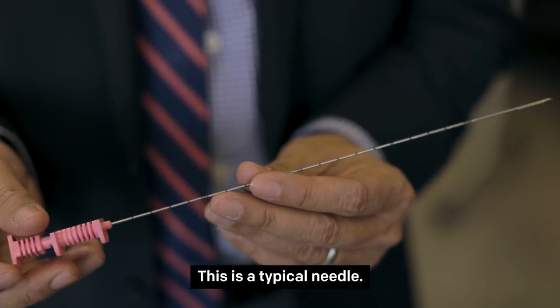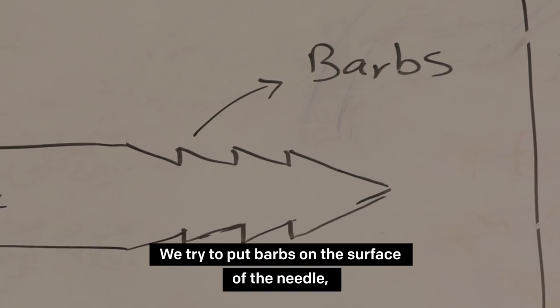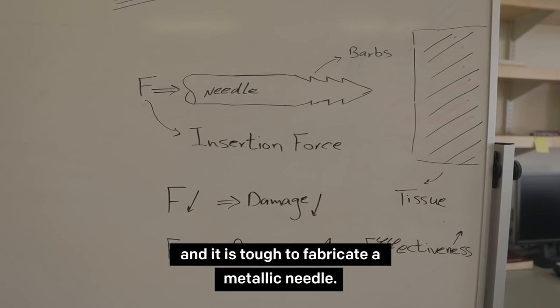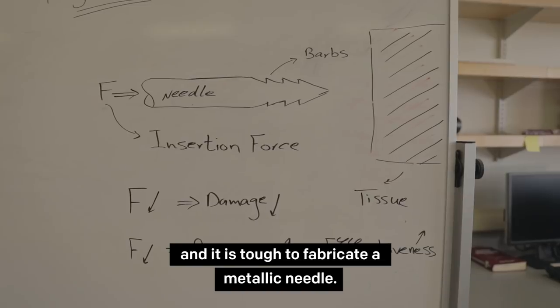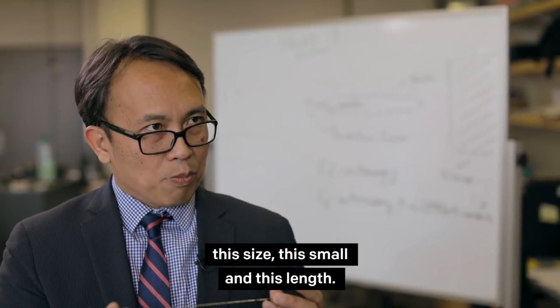This is a typical needle — this is metal. We tried to put barbs on the surface of the needle, but it is tough to fabricate a metallic needle, especially for a needle this size, this small, and this length.